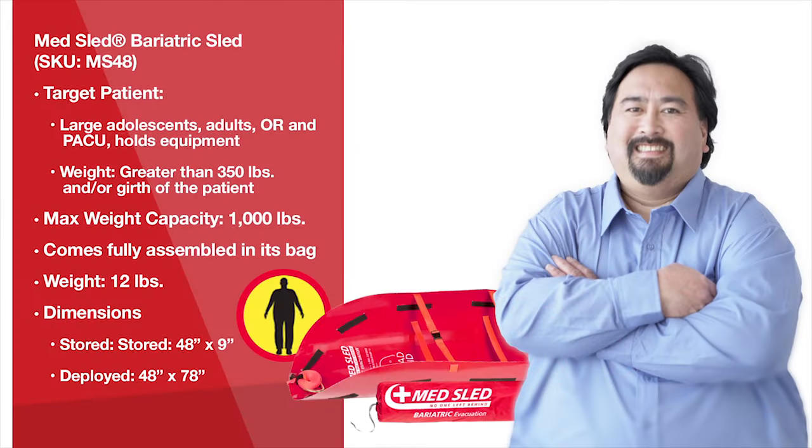Lastly, our Bariatric MedSled is designed to handle your largest patients. It is not a question of the patient's weight but rather their girth. For those larger patients, our Bariatric Sled provides an additional 12 inches of width. The Bariatric Sled is also ideal for your sickest ICU, PACU, and post-op patients that may need to be transported with additional padding and or life support equipment.